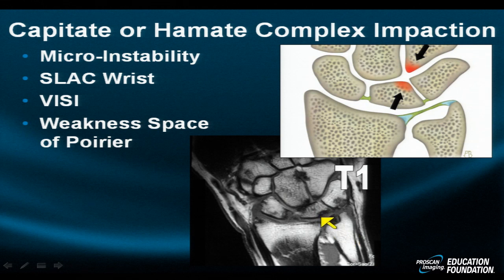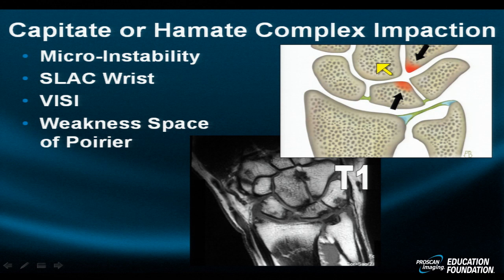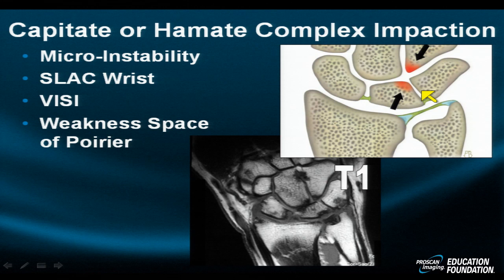This is a combined complex instability in which the patient has both mid-carpal instabilities resulting in hamato-lunate and capito-lunate abutment, as well as ulno-triquetral abutment. The fact that the ulna is not protruding distally should not dissuade you from the diagnosis, as this protrusion may occur in various other wrist positions. There is also a region in the mid-carpal space known as the space of Poirier — a weak space that allows proximal and palmar capitate migration, especially when the ulnar limb of the V ligament is ruptured, leading to volar intercalary segmental instability and perhaps scapholunate advanced collapse or slack wrist.